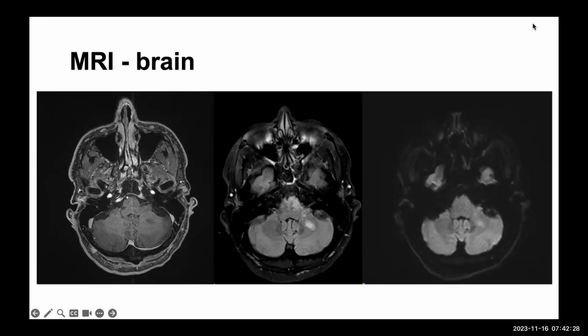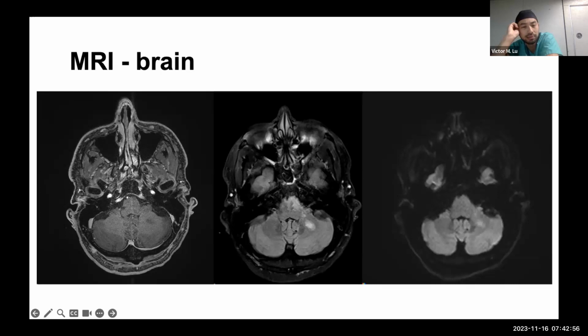So looking at the posterior fossa lesions, you always have to have a metastasis differential, a lymphoma differential. It could be glioma at this point. I don't have a high suspicion, based also on it involving the brainstem, that this would be a schwannoma. That would be hemangioblastoma, I guess, but it doesn't look like it'd be a very vascular lesion either.